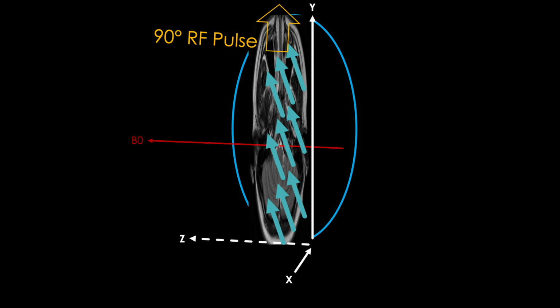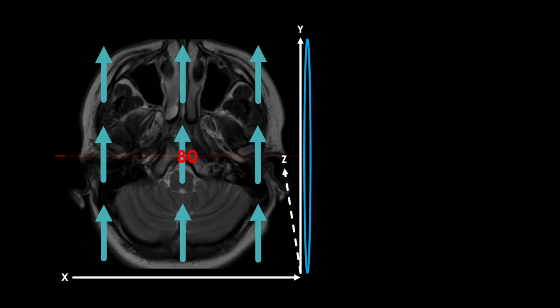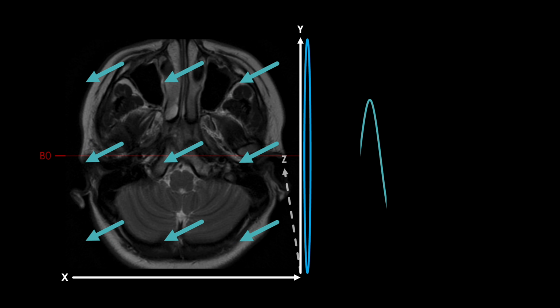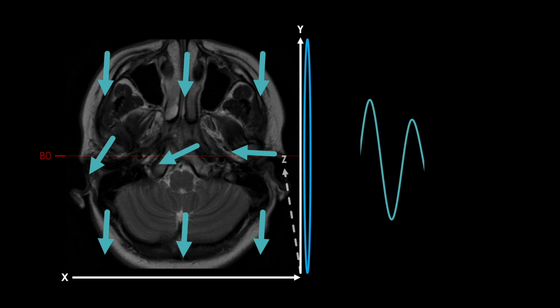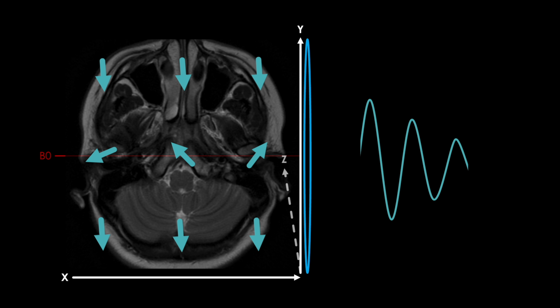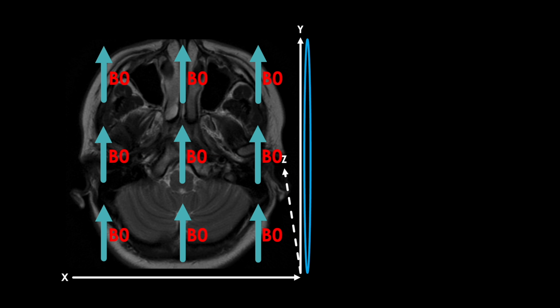So far, we've assumed that we have a perfectly uniform magnetic field, that this voxel sees B0 at baseline, as do all the rest. And so all of these spins precess at the same rate once knocked into the XY plane, and the only reason that they start to dephase with some spinning faster or slower than the others is solely due to T2 effects, or local interactions between these spins. And unfortunately, we have two problems. No matter how hard we try, we can't produce a perfectly uniform external magnetic field. It's imperfect or inhomogeneous, particularly around the periphery.